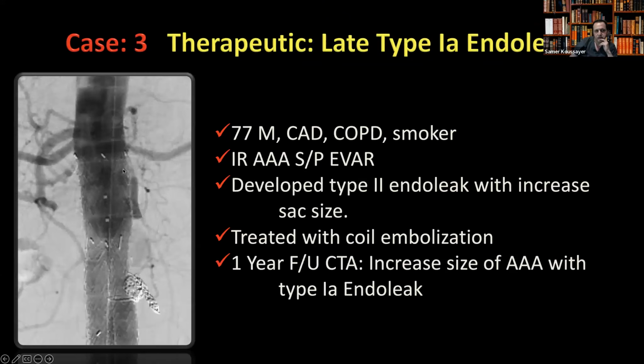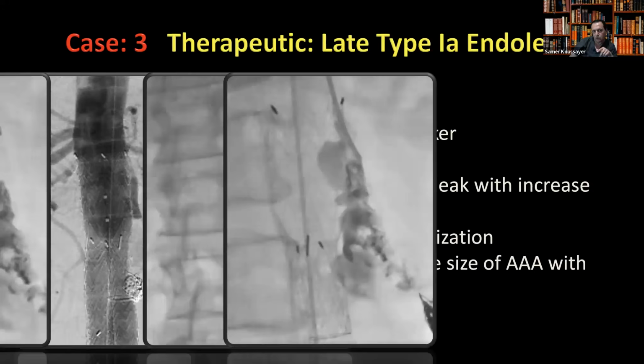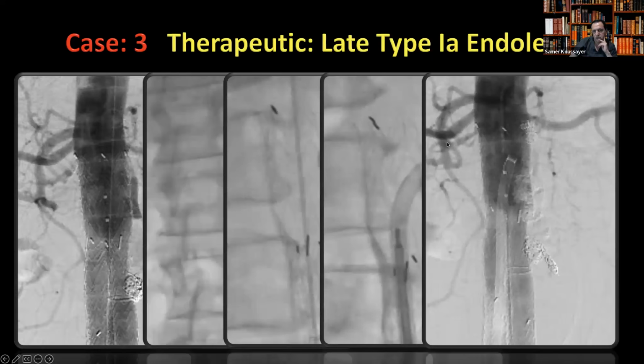Type 1 endoleak here. But you see it's a big gap. They put a coil here, and it did not work. The gap is big here, but here the gap is small. It's okay, you can put the anchors here because they are going to be very close to the renal. Even if the gap is big here, it doesn't matter because the Endoanchors go here. But because the gap is big here, we put Onyx inside, and then we put Endoanchors here. After we put Onyx, we put Endoanchors, and it worked very well.